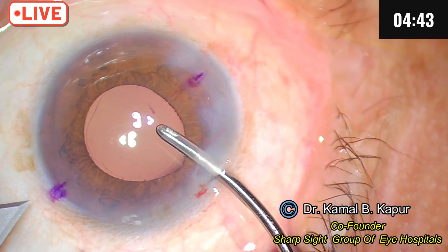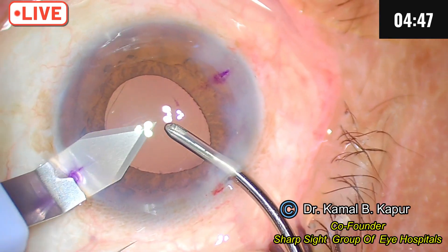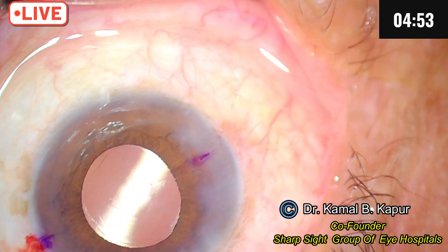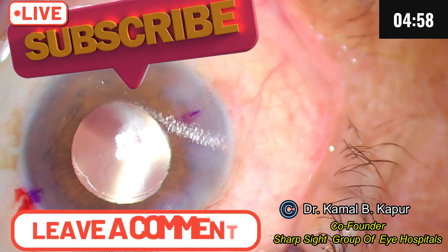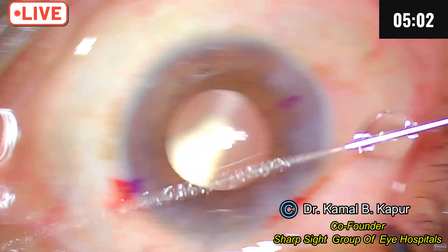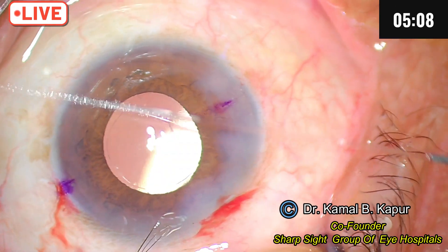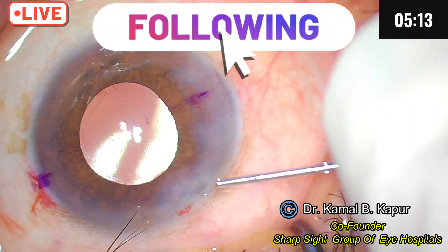Now we will do the OCCI. I will have the blade at the center and go a complete incision through. At 2.8 mm of incision on both sides, this effectively reduces astigmatism by 0.75 to 0.8 very comfortably. This patient has a pre-existing astigmatism of one diopter at 25 degrees. We had pre-marked the 25 degrees and we will have an end result of probably 0.3 or 0.4, which does the job.